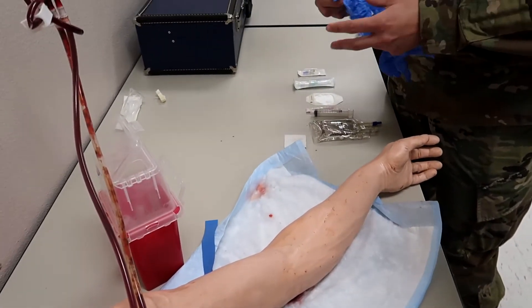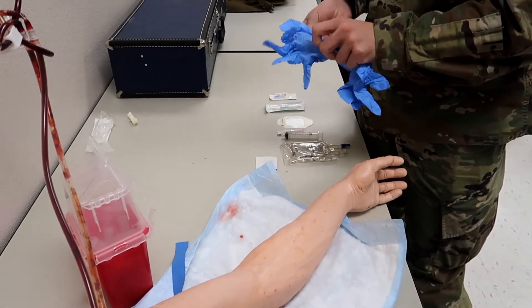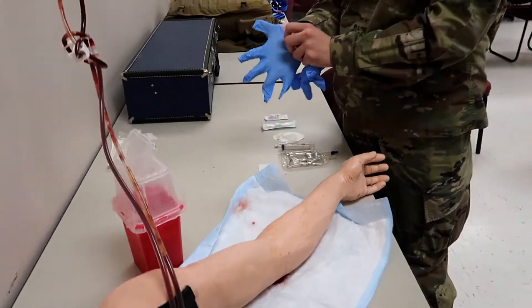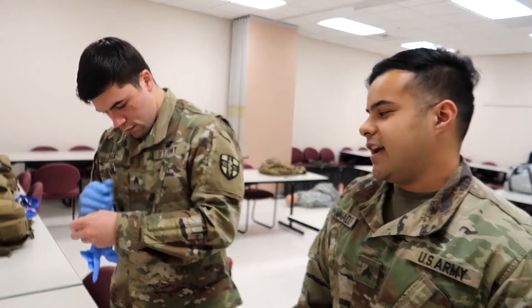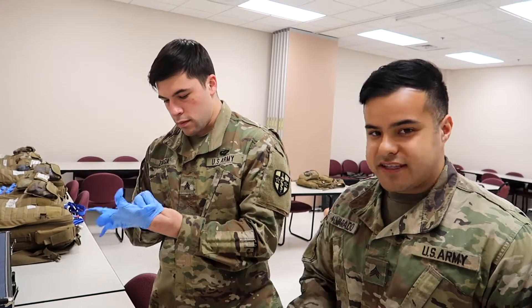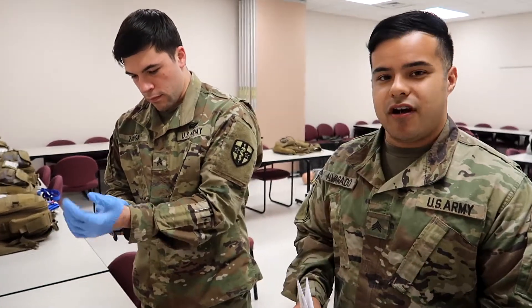So step one of initiating the saline lock — you're going to take a BSI. As you can see, he's doing that. And guys, gloves are killer. They'll cut your time down, they'll mess you up when you're messing around with tape and things. So it's always good to have a method to get them on.